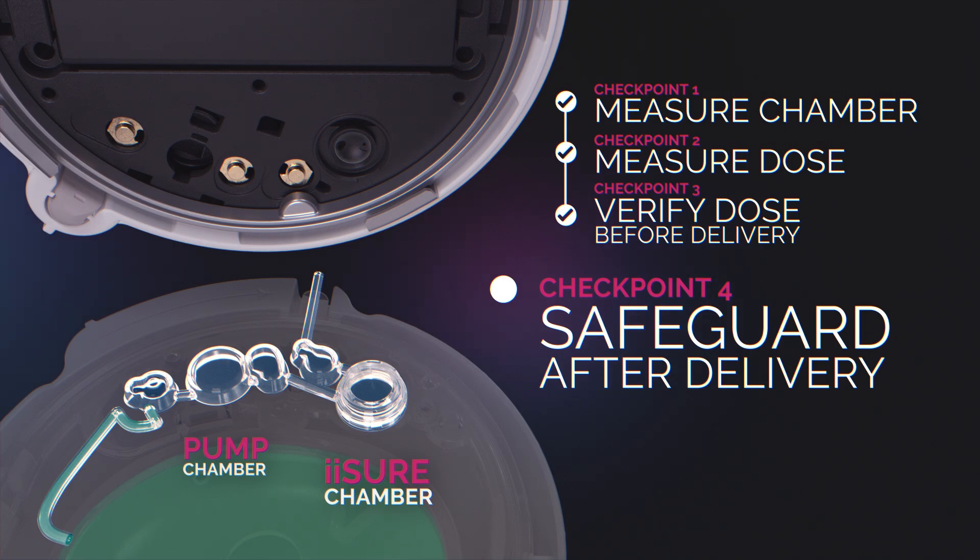After the dose is delivered, the iSure sensor takes a final measurement of the iSure chamber. This allows the system to calculate the amount of insulin delivered to the user.